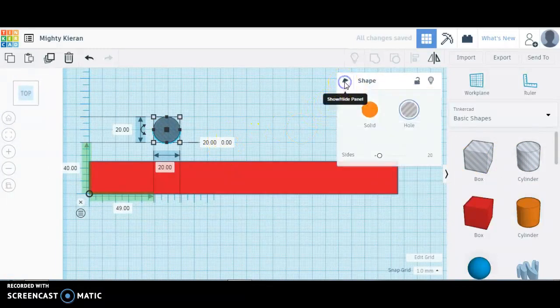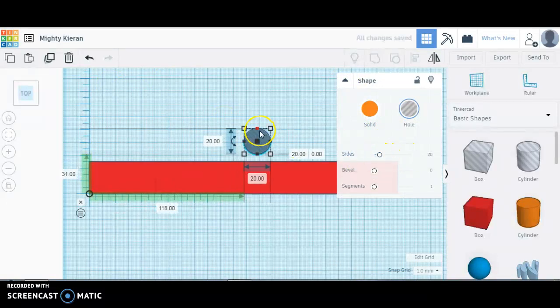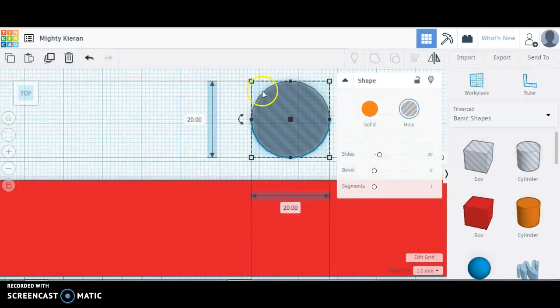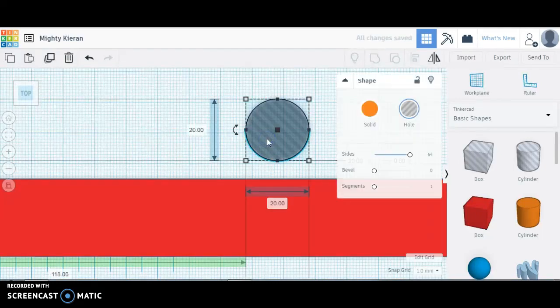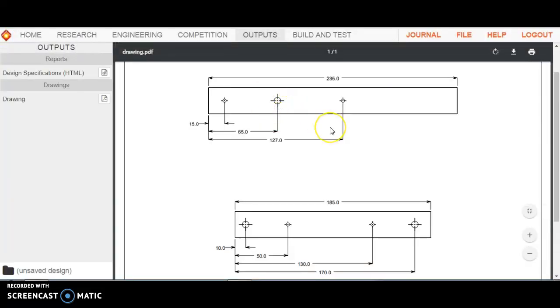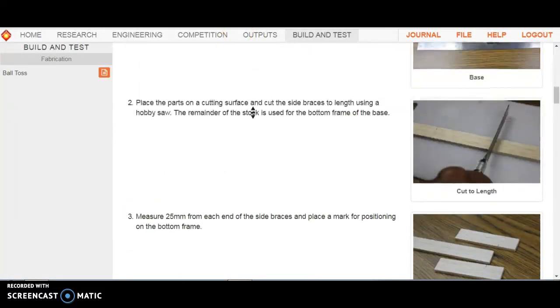The first thing I would point out is that I like to make sure that I've set the number of sides on the hole to the maximum. Okay, zoomed in, you can see that with 20 sides, you can sort of see the number of sides. Of course, we want this circle to be as smooth as possible, so just set to the maximum number of sides. Now, with the circle selected, I can also adjust the diameter. The engineering drawing does not show the diameter of these holes. I had to find that in the Build and Test instructions also.